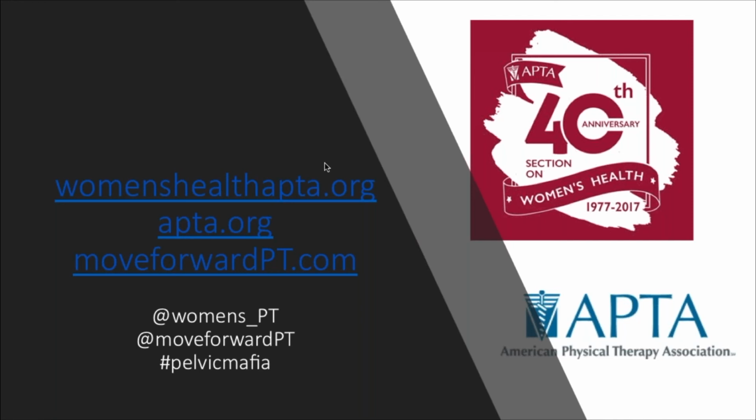I think the other limitation is that, to have a good sense of what's going on, it's nice to have a good full bladder. You may have patients who come in and have gone to the bathroom immediately before their evaluation because they think you're going to do a pelvic floor exam, and so you're not able to assess without giving them a couple of cups of water. So the limitations there would be, I think, the patient.